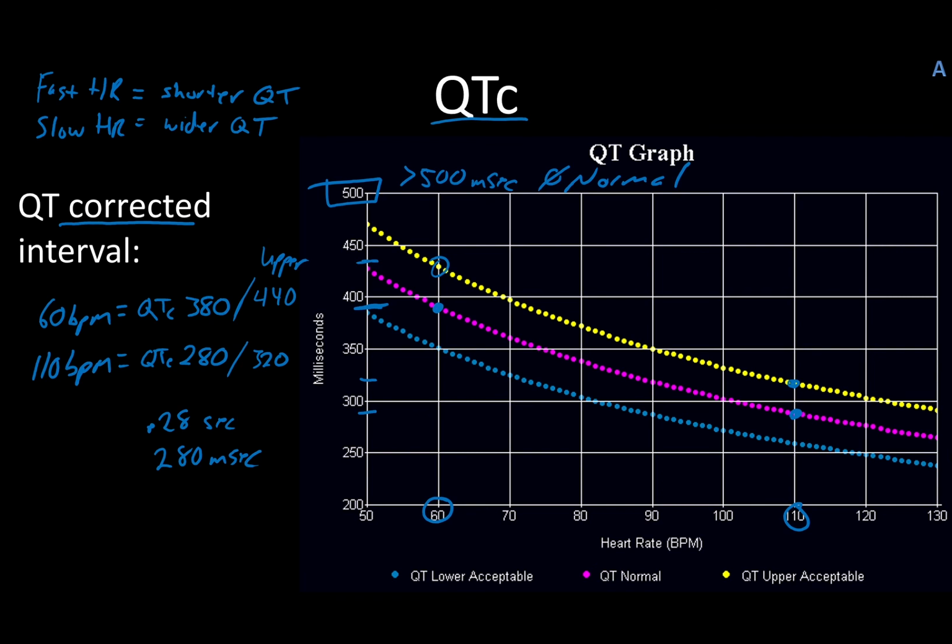Now, you're likely to actually have some elevation in the patients that come through a hospital, simply because they may have a history of cardiac disease or medications that they're taking on purpose to slow down their heart rate, and one of those side effects is QTc being widened. What's most important, though, is it worsens with severity of cardiac dysfunction. So if their heart is doing poorly, the QTc will get worse. So keep track of that, kids.